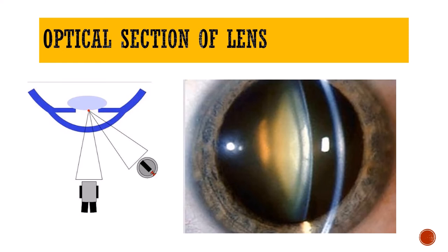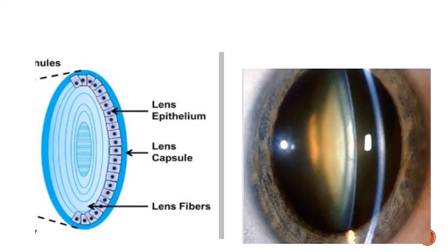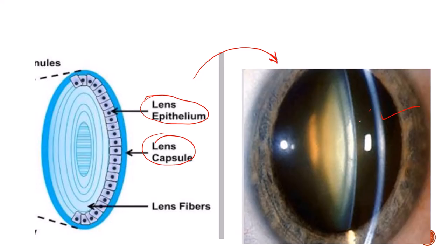Just as we have an optical section of the cornea, we also have an optical section of the lens. Here you move the joystick a little further forward toward the patient to focus light onto the surface of the lens. In the optical section of the lens you can see various lens layers. This is the optical section from the cornea, then the anterior chamber, and from here the lens begins. The anterior part of the lens, posterior part, lens capsule, lens epithelium, cortex, and nucleus are all visible.